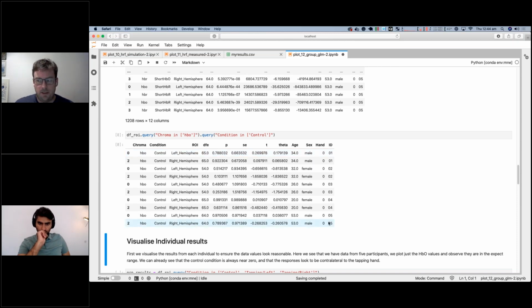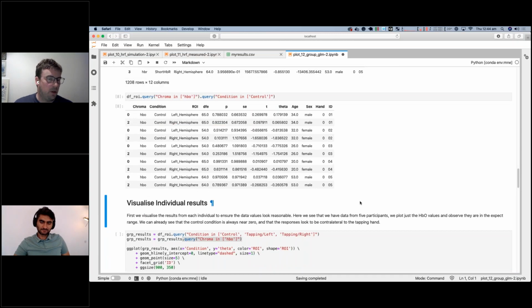All make sense so far? Yep. Okay. So looking at tables is confusing.